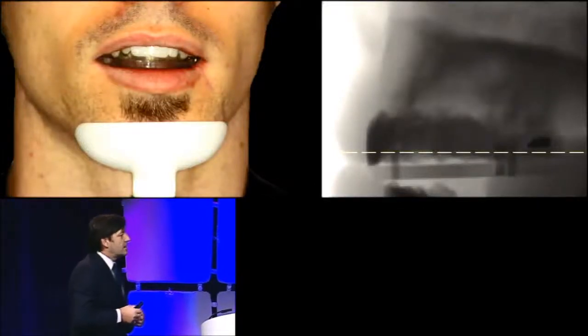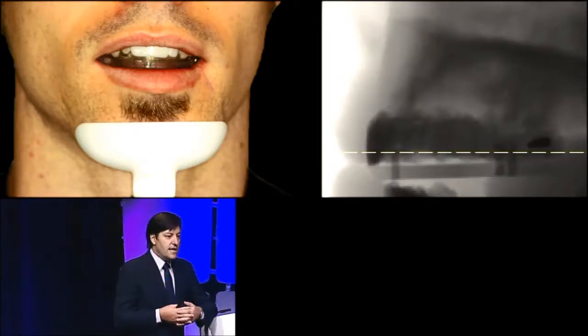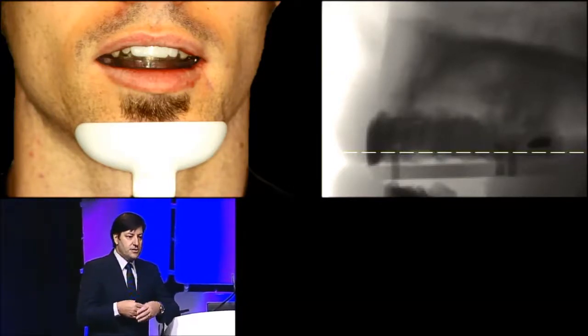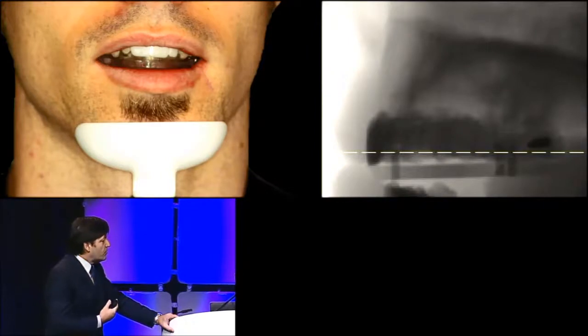When you look at the level of implementation, I have to recognize that since we started using the cone beam CT technology, the DICOM file, we reduced the radiation for the patients. They are commonly accepted. Most of you or some specialists may have it in the office or not. It allowed us to get the data acquisition digitally from the radiographic viewpoint.